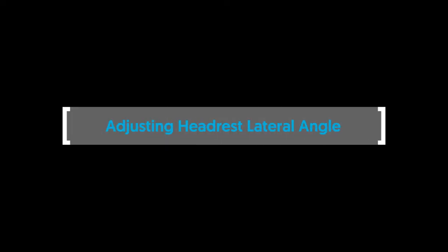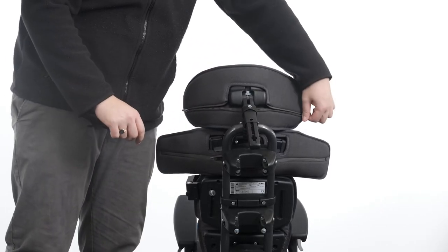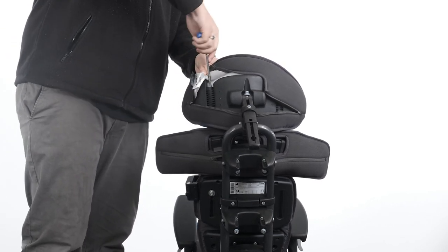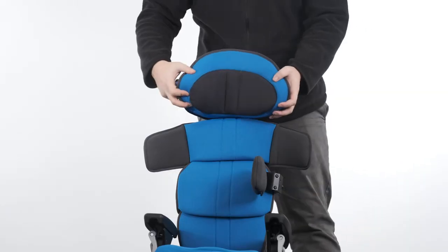Adjusting headrest lateral angle. To adjust the angle of the headrest laterals, unzip the cover on both sides to access the adjustment bolt from above. Loosen the bolt and move the headrest lateral to the desired position. Tighten the bolt to secure in position and zip up the cover.